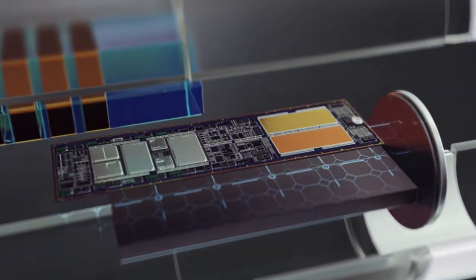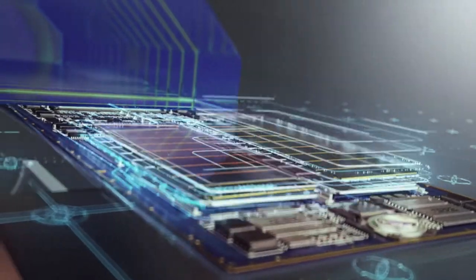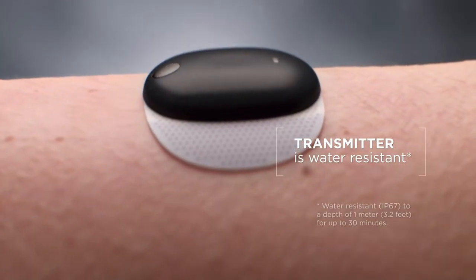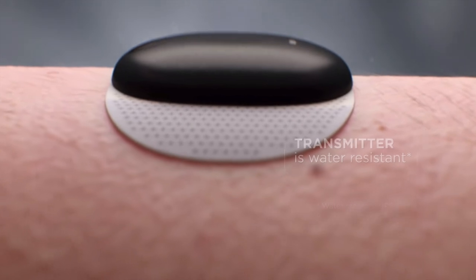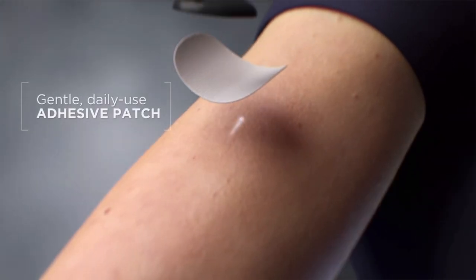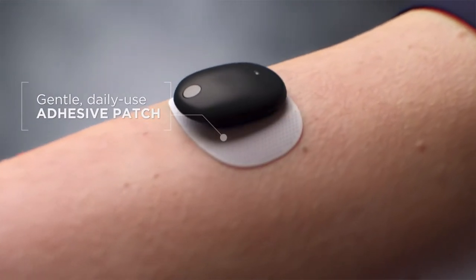There is no battery in the sensor itself because the sensor is wirelessly powered by the transmitter. The transmitter is sleek — not as small as the Freestyle Libre, but comparable to the Dexcom G6 in size — and it can be secured to the skin on your upper arm with a gentle double-sided silicone adhesive tape.